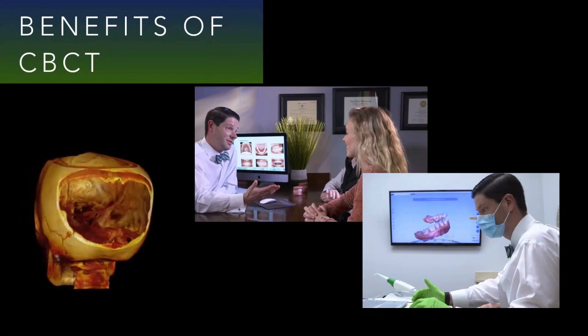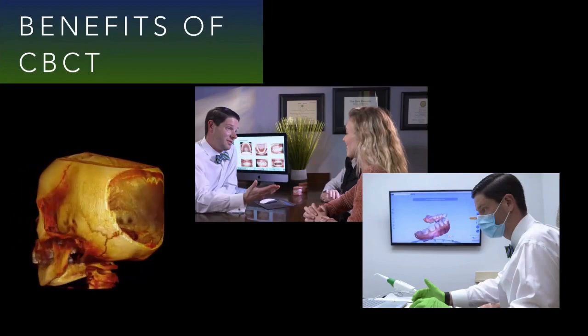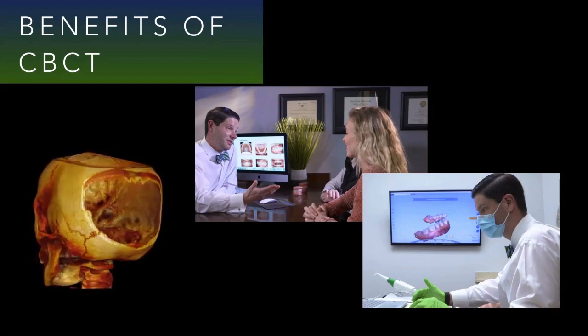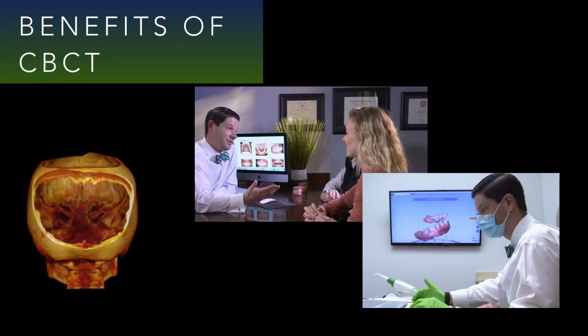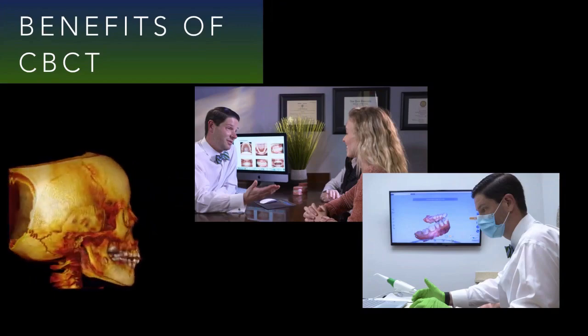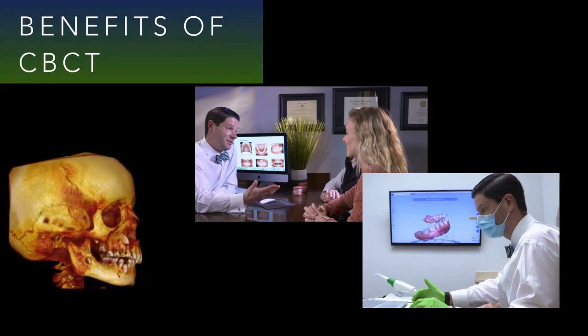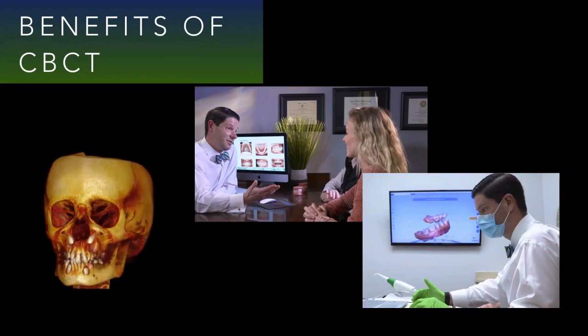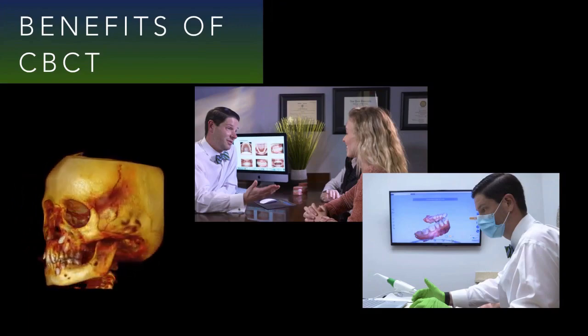The ability to then explain what you're planning on doing using a rendered 3D rendering of the patient really allows greater opportunity for explaining what it is that you're doing. So that is one benefit that I had not intended on getting, but just kind of happenstance got.